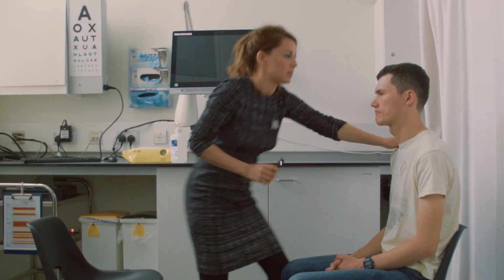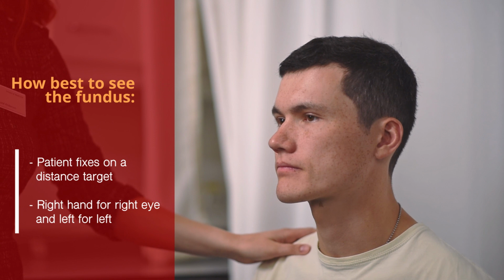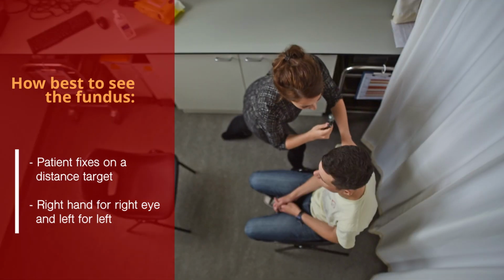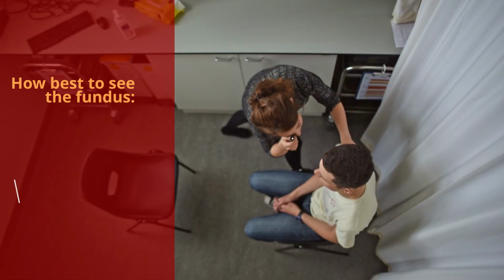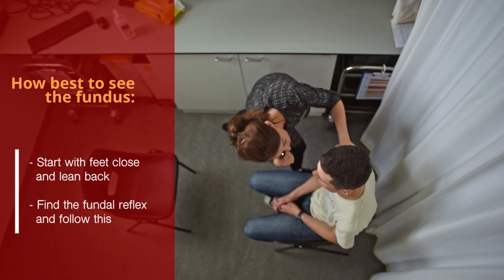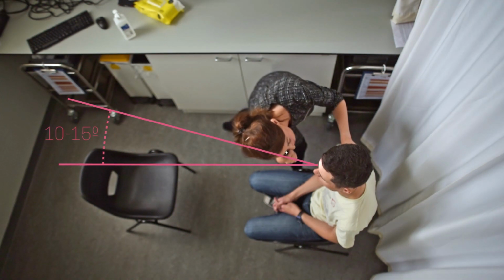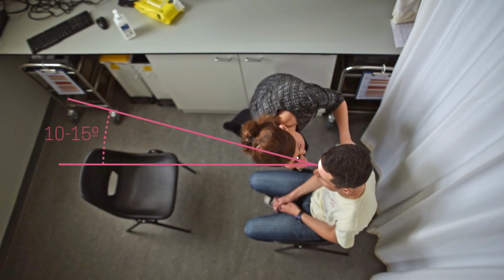Next, examine the back of the eye. Ask the patient to fix on a target in the distance. Use your right hand and right eye to examine their right eye and your left for their left. Start with your feet close to the patient and lean back. Identify the fundal reflex and follow this, moving in on a path 10 to 15 degrees temporal on the horizontal.